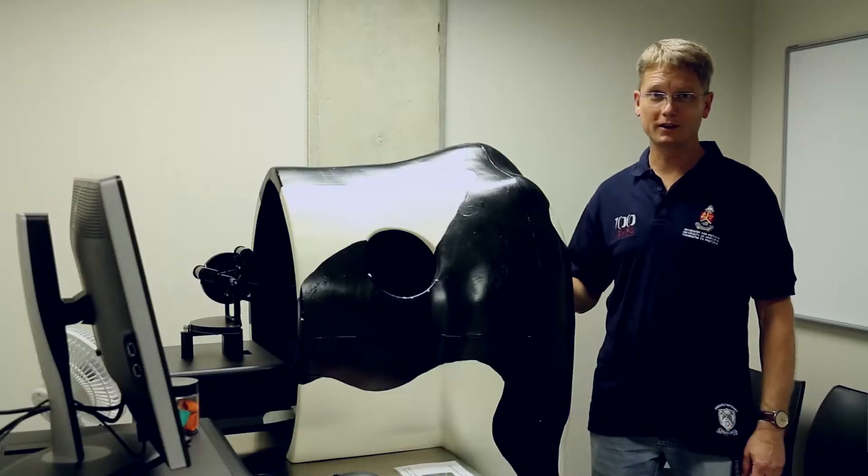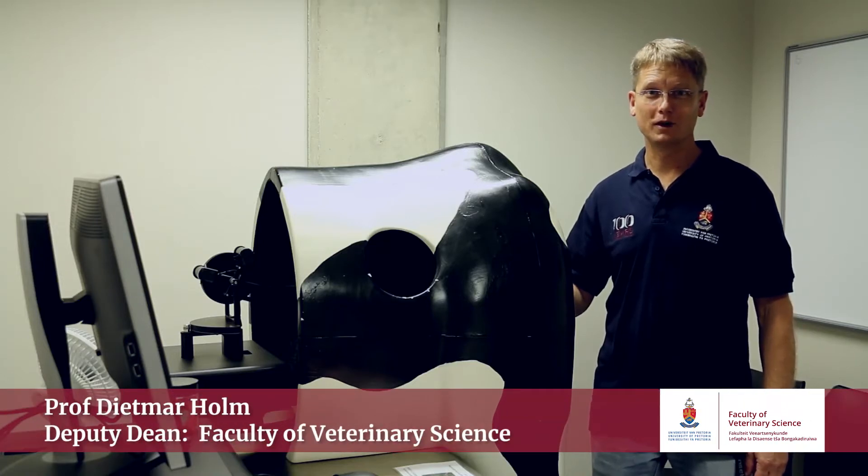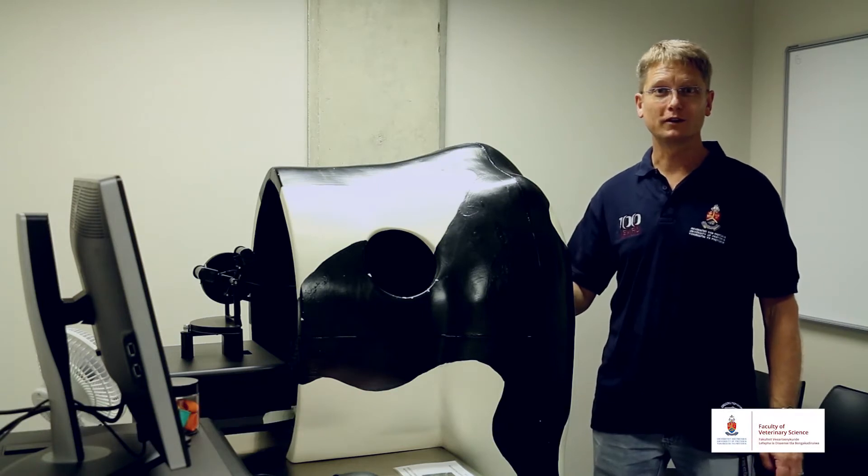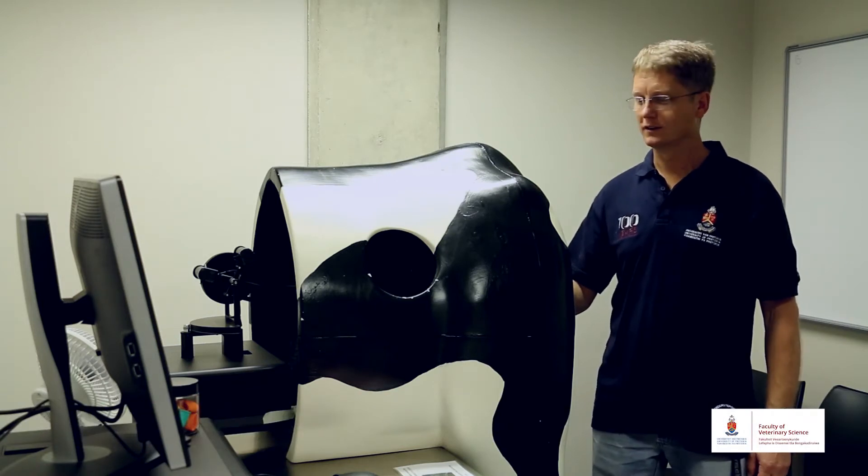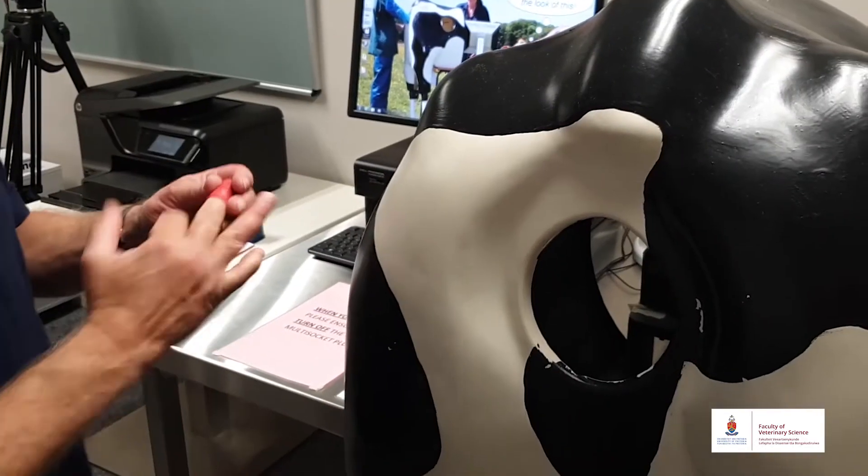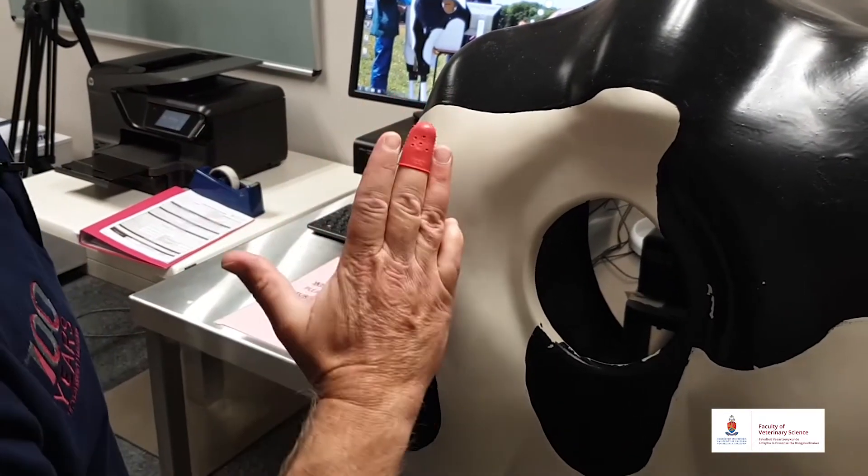This is the haptic cow model. It is the most high-tech model that we have in the Skills Lab at Onertepoort. I'm going to demonstrate how this works. So first of all I start by putting a rubber thimble on my finger and then I insert my hand into the model.